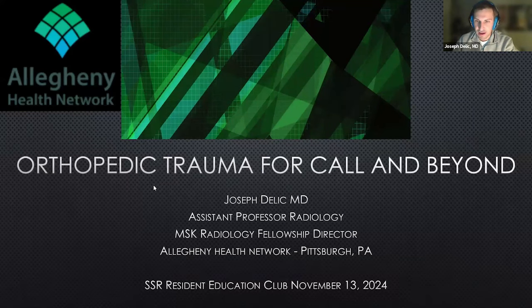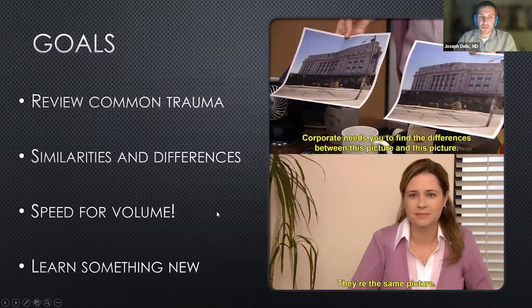So let's go into our goals here this evening. What do we want to talk about? Well, I want to review some common trauma cases. And specifically, I want to focus on what are some cases that are similar, and then what are the differences between them that can help us determine what the diagnosis is.